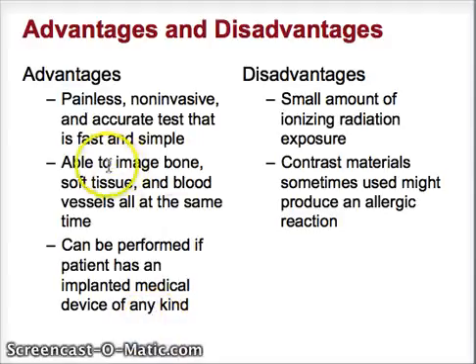This is nice. You can see soft tissue in this one. And you can also see it all along with the bone. You can see it all together. Again, it's painless, non-invasive, just like an x-ray. And if there's any medical device that's been implanted, it can be taken just the same as an x-ray.